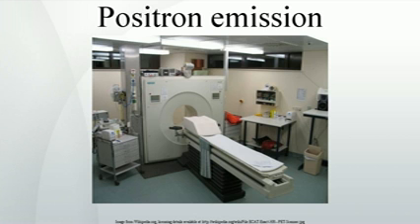Limitations to the widespread use of PET arise from the high costs of cyclotrons needed to produce the short-lived radionuclides for PET scanning and the need for specially adapted on-site chemical synthesis apparatus to produce the radiopharmaceuticals after radioisotope preparation.